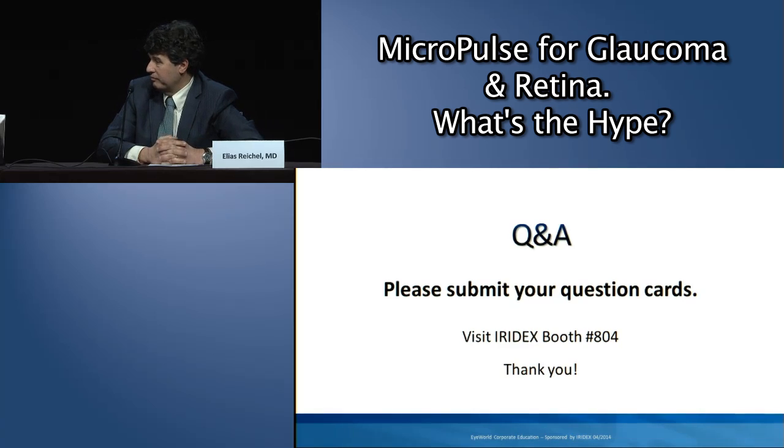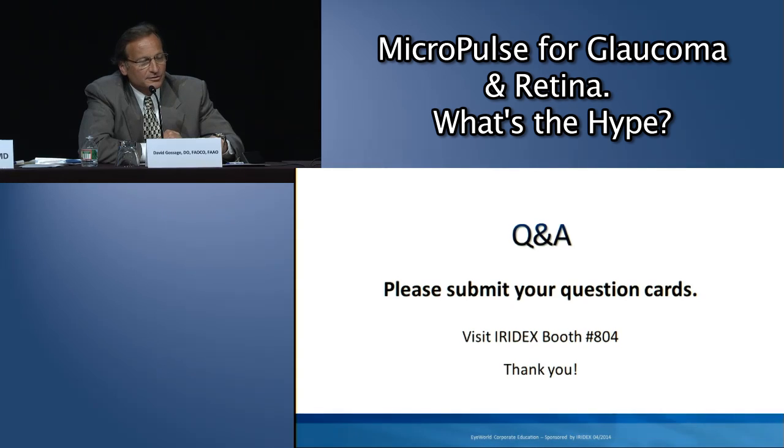The other thing with the yellow, for doing PRPs, we do what we call mini pulse. We set it at 20 milliseconds, and you can do a very fast PRP, which almost becomes painless for the patient. So the one nice thing about the 577 is you can treat at lesser powers and still get a nice uptake in the retina versus the 532.